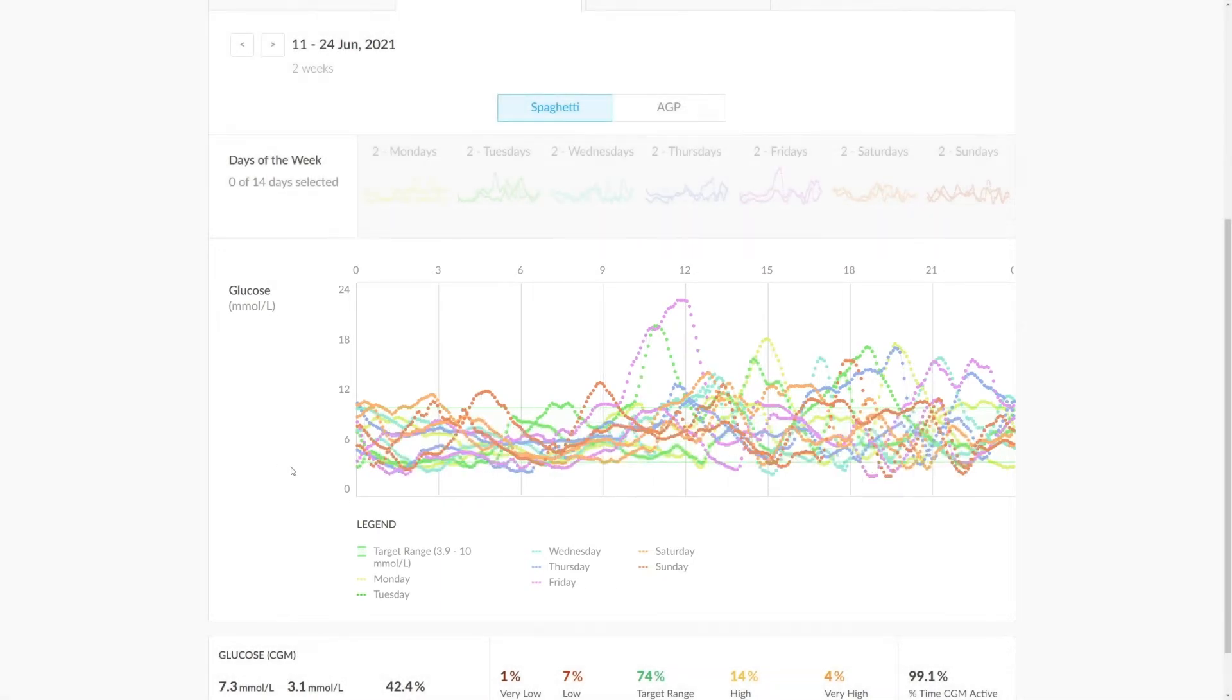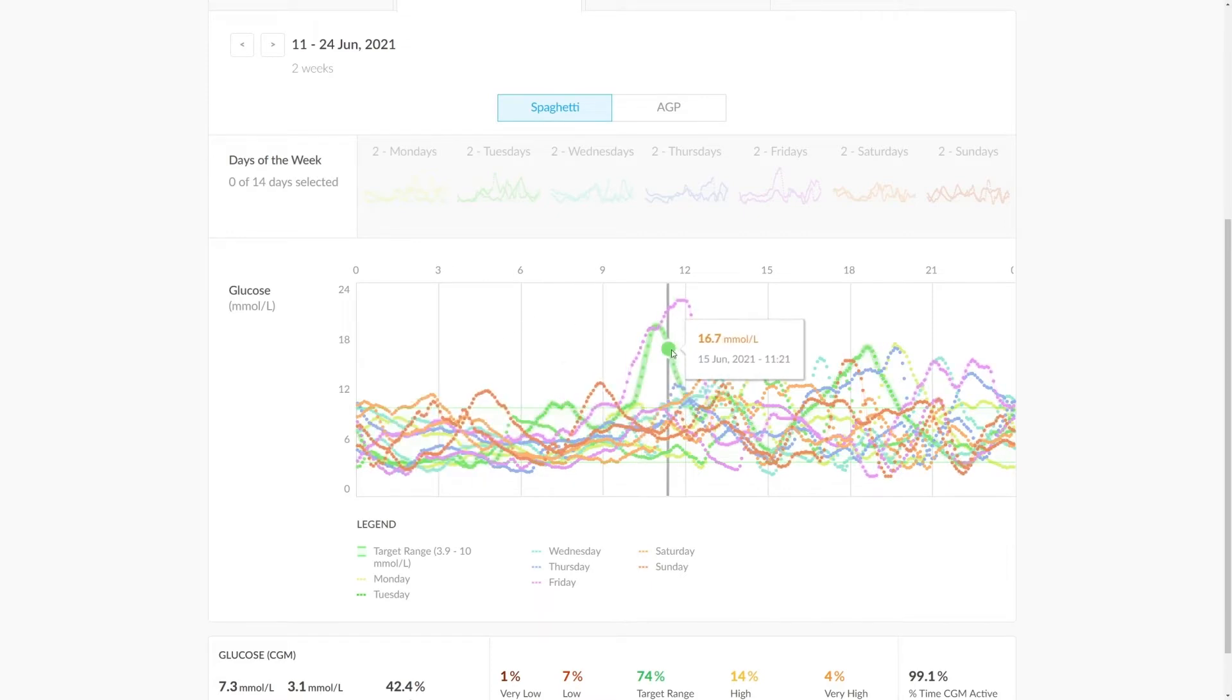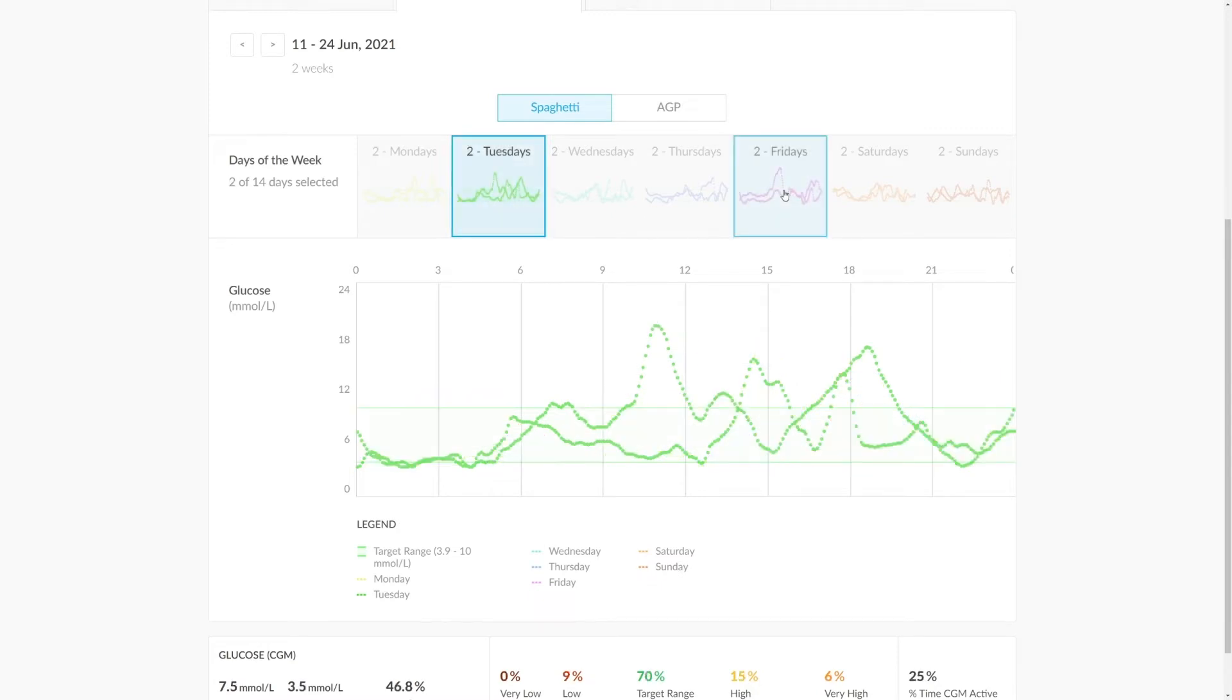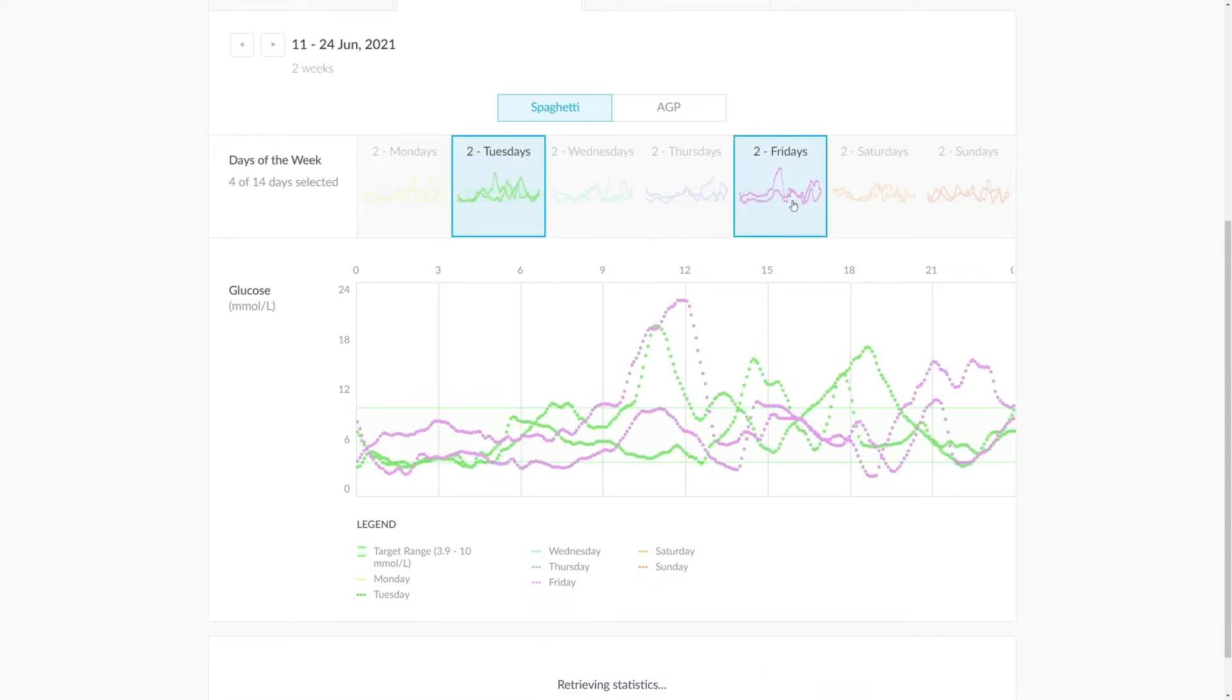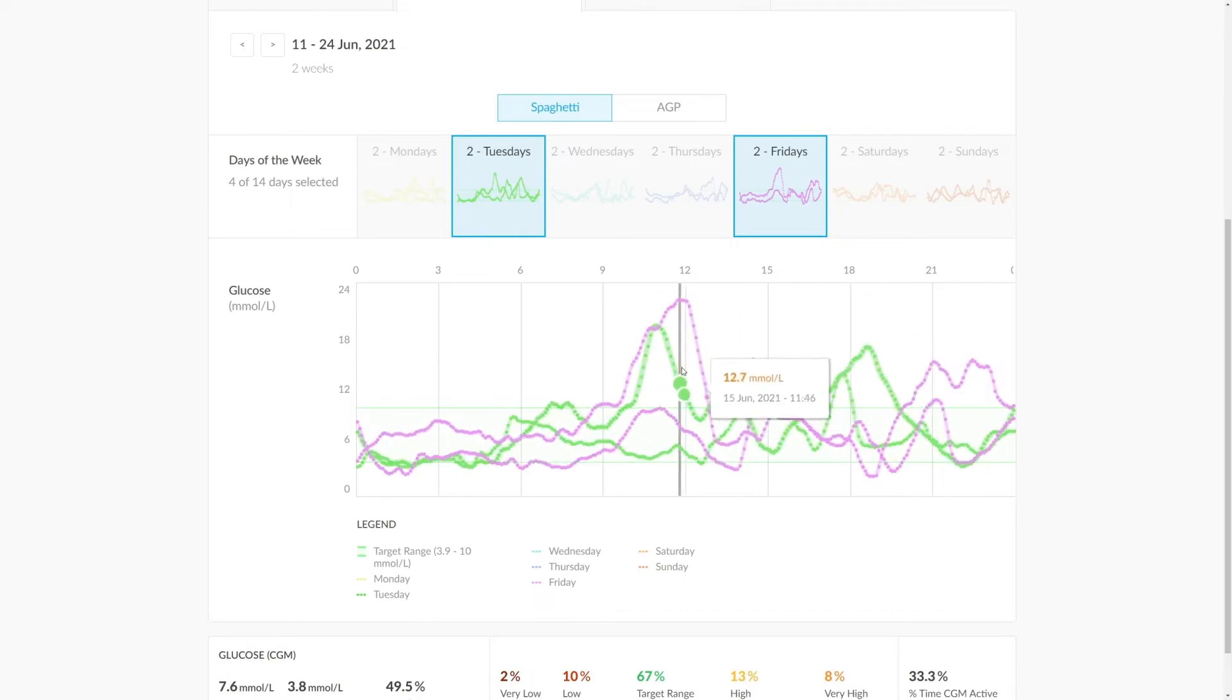So we're going to want to select the days that we want to focus on. For instance, if we're looking at high peaks within this control, we can see that we have a green and a red line. Now that corresponds to our Tuesdays and Fridays. Here we have now isolated those peaks.